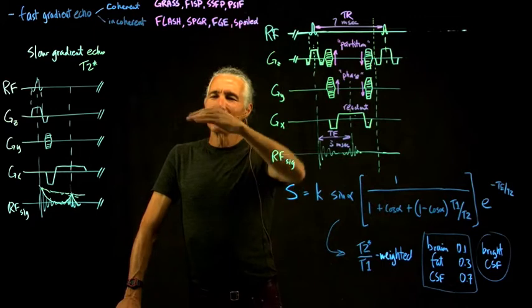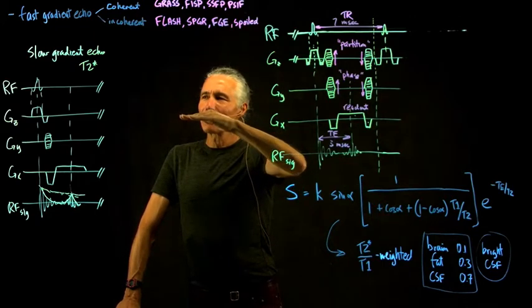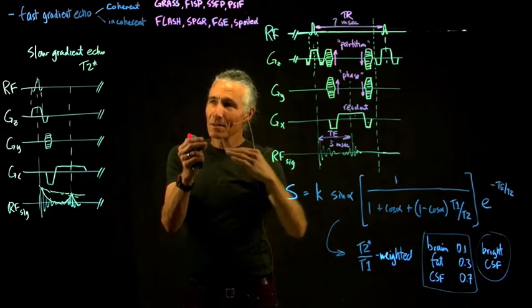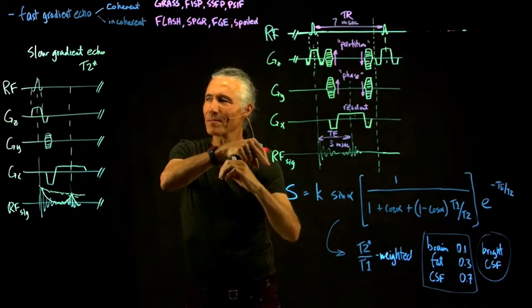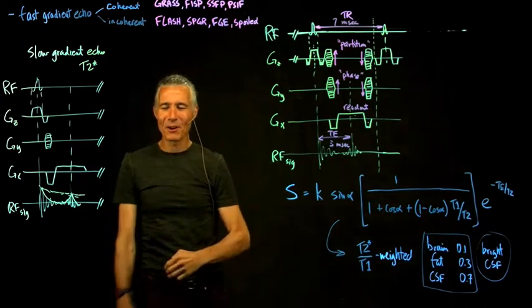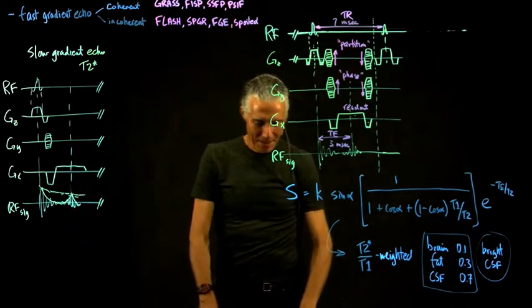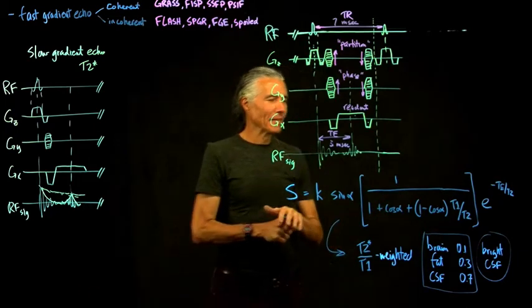You can see the flat top surface of the banana milkshake, and then during the swallowing, you can see the trachea is open, and you can see this sudden closing of the trachea as all the banana milkshake goes down the right pipe. So yeah, you can use it for all different kinds of things.